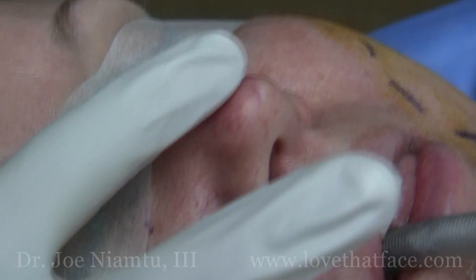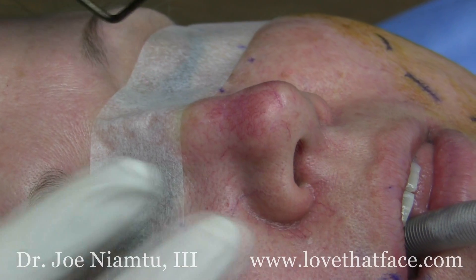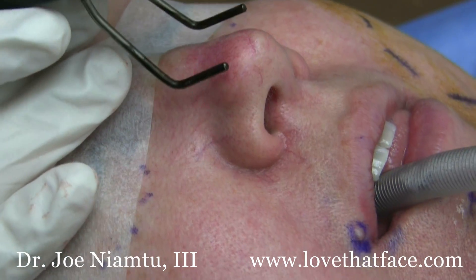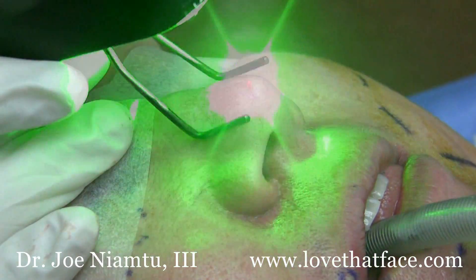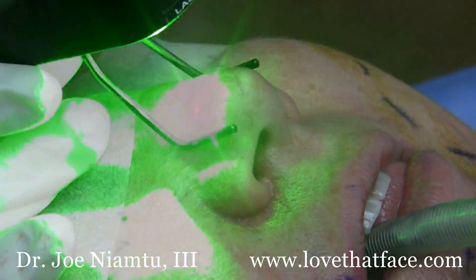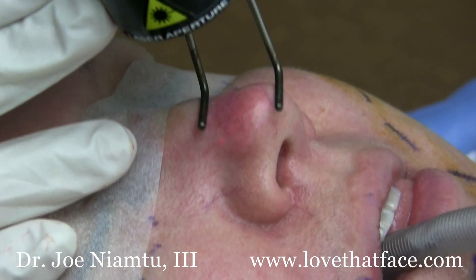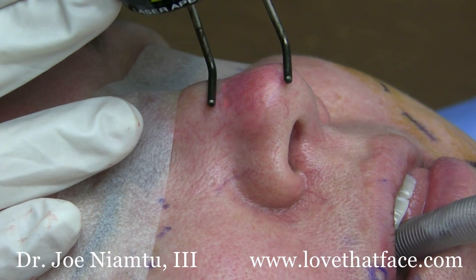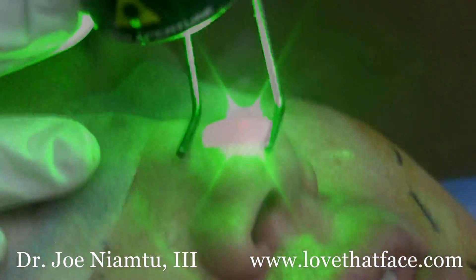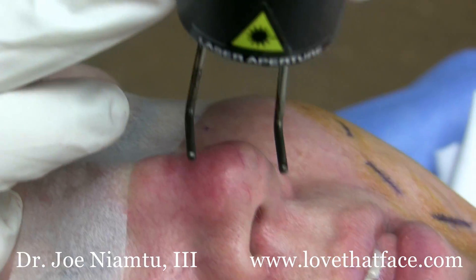This patient has a lot of matted telangiectasias from a skin cancer removal, and we're going to treat these with the Iridex 532 on the scanning handpiece. This is on about 20 joules per centimeter squared, and the nice thing is that you don't have to trace these individually. So we're going to alternate direction, and you can see how nicely these are resolving.